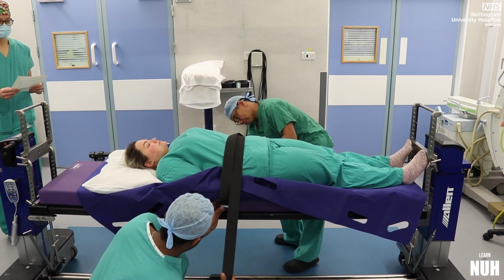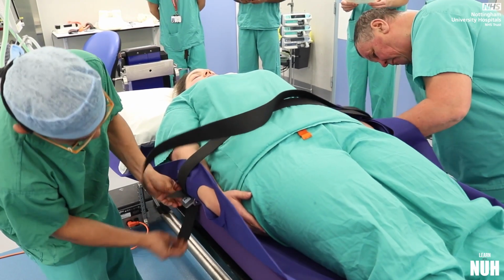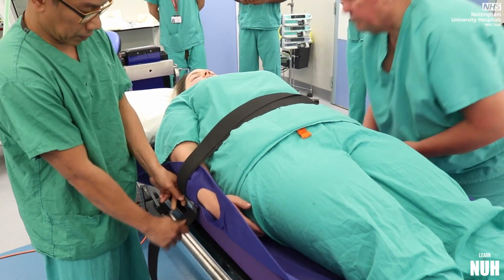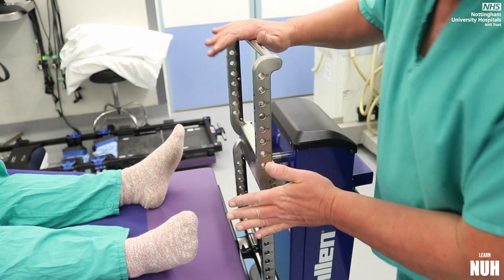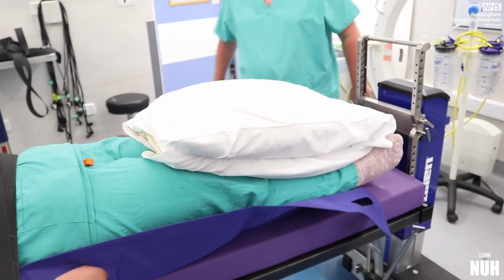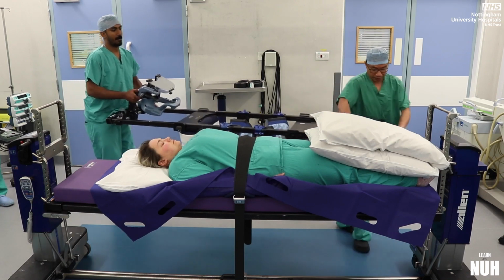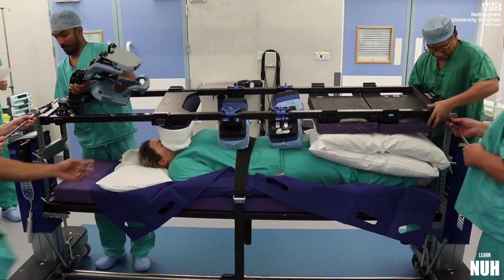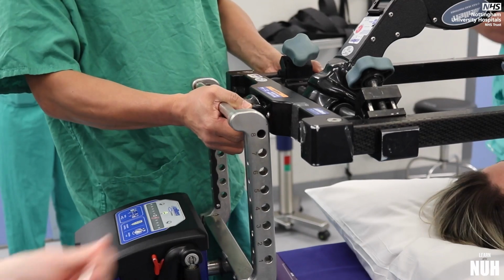Secure the arms using the arm retaining strap. Attach the H-bars to the Allen table, top and bottom, using the long T-handled pins, which should all be inserted in the same direction. Place 2 pillows over the patient's lower legs. Align the prone frame over the patient and attach to the Allen table through the top holes using the long T-handled pins.